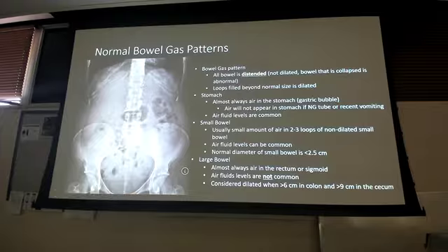So another thing with the large bowel versus the small bowel, right? If I stand you upright, how often do you think you would expect to see air fluid levels in the large bowel?